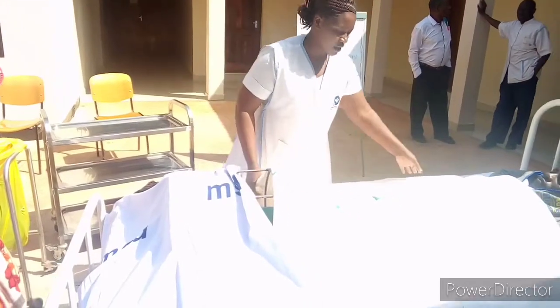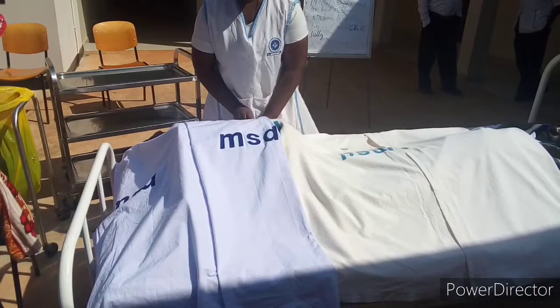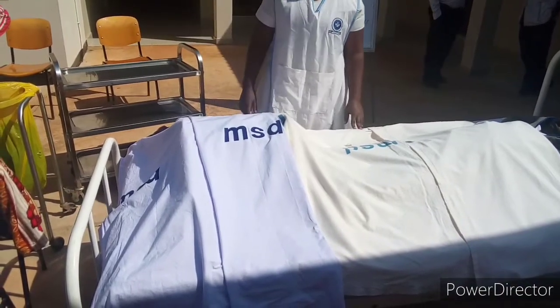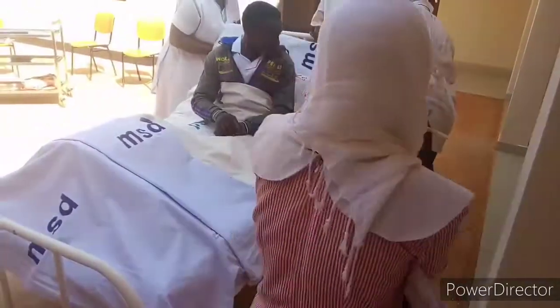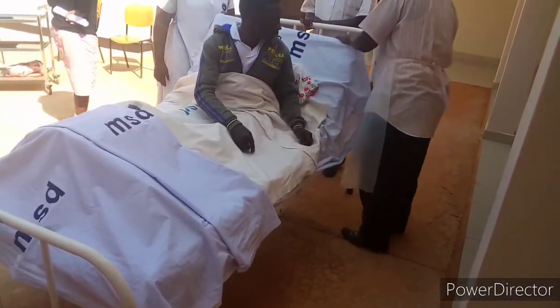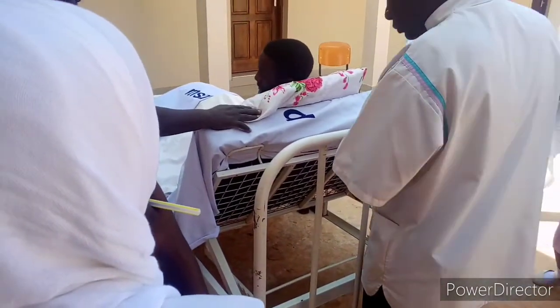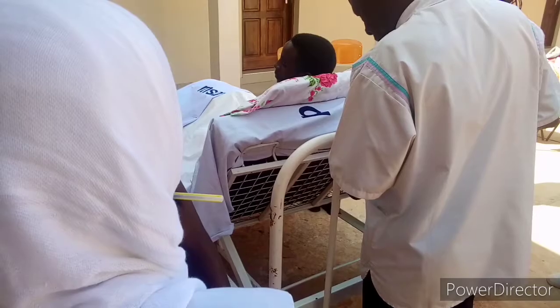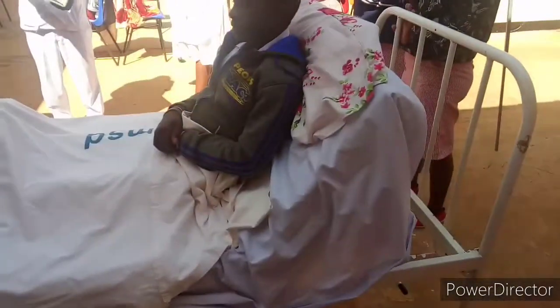As you have seen in my video, that is the divided bed, also called an amputation bed. After finishing, you close it. When a patient needs adjusting, you adjust them according to the type of bed you have, and the patient should be placed in the sitting-up position.